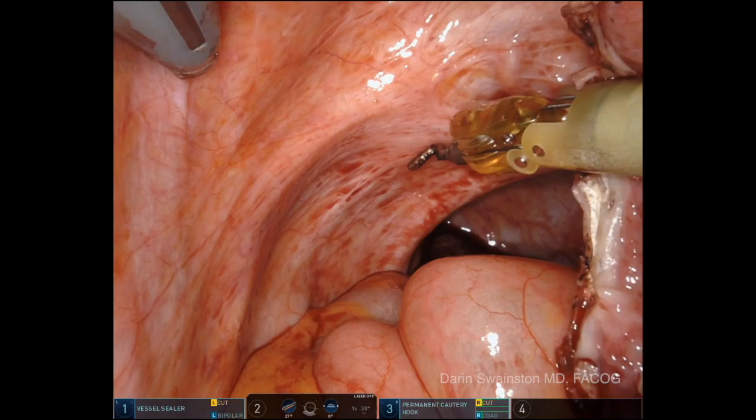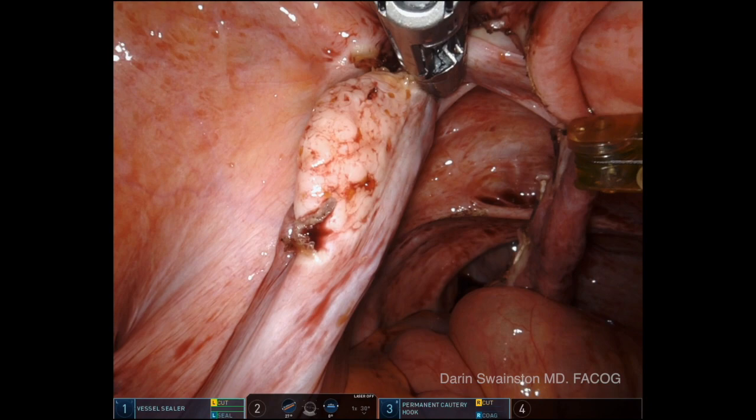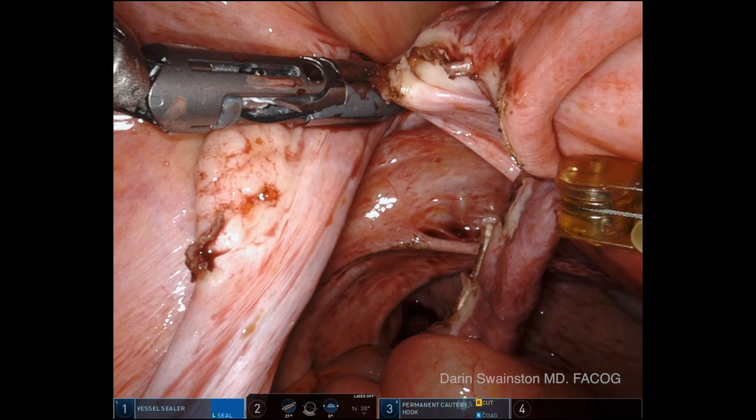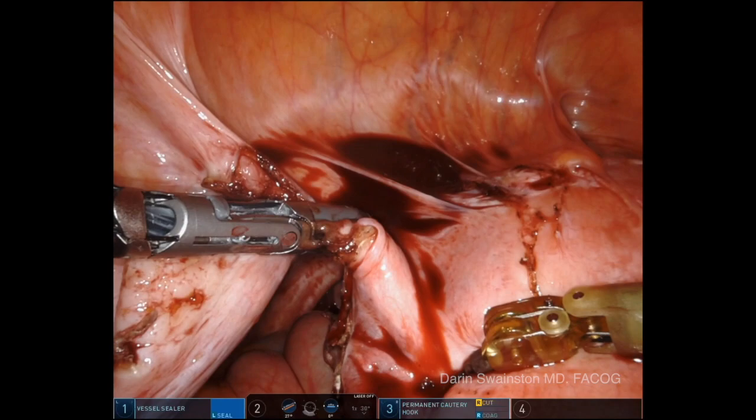I'm actually going to mark right there just to remind me to stay away from that when I'm closing the cuff. And I'm lifting up away from that when I'm taking the uterine ovarian ligament with the vessel sealer, headed toward the round ligament that I've already dissected open earlier from the other side, and I did the anterior broad ligament from the other side over.